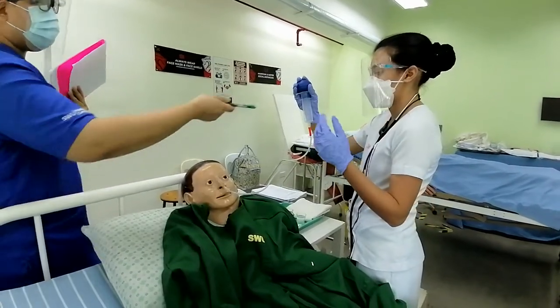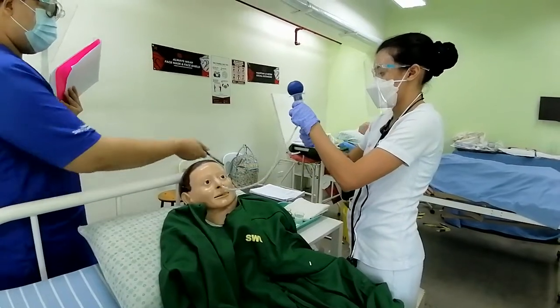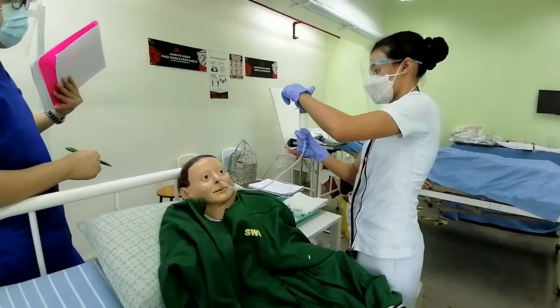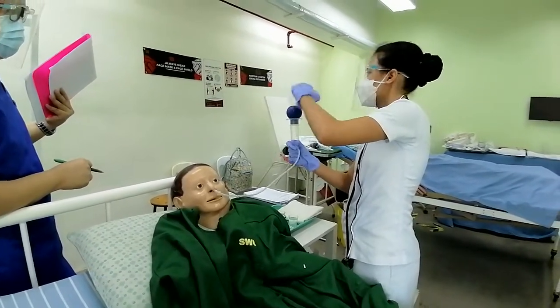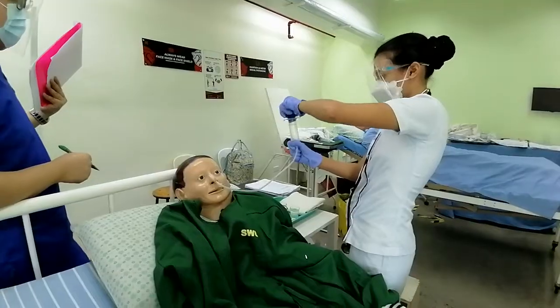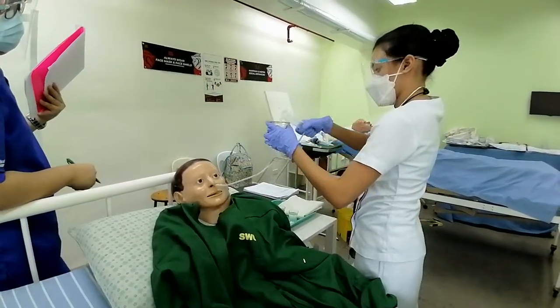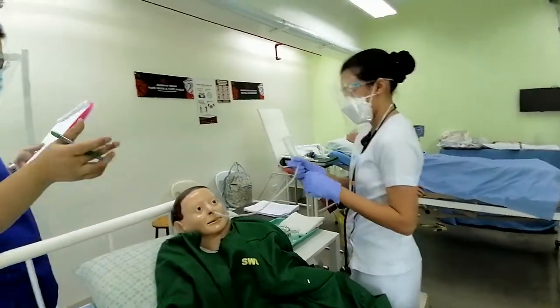Okay, how are you going to take off the residual volume? Use that container. Are you going to discard it? I will give it to the doctor. Okay. Why? As proof, sir, that that's the residual. Okay. Then proceed with the next one.